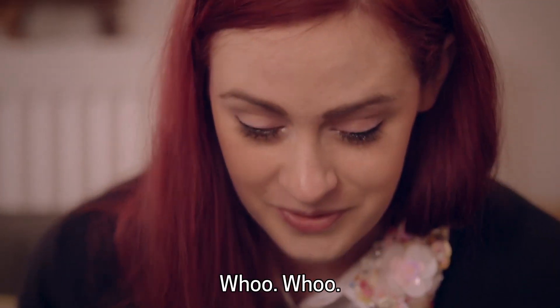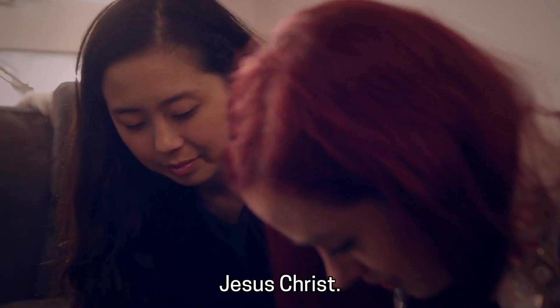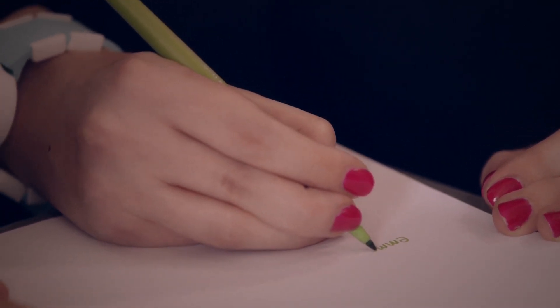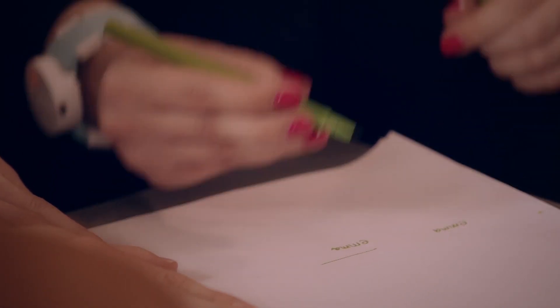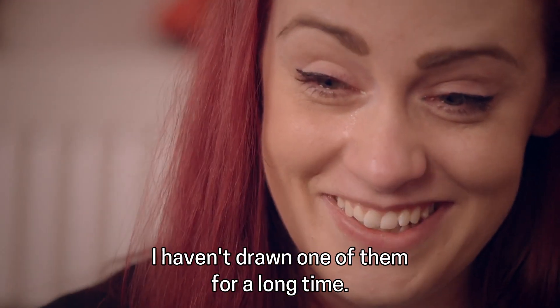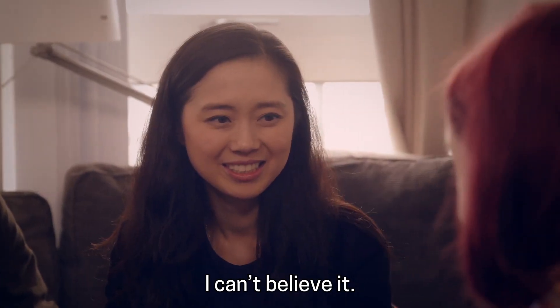It makes me forget that I have a tremor. I've drawn one of them for a long time. I've actually just written my name for the first time in ages. I can't believe it.